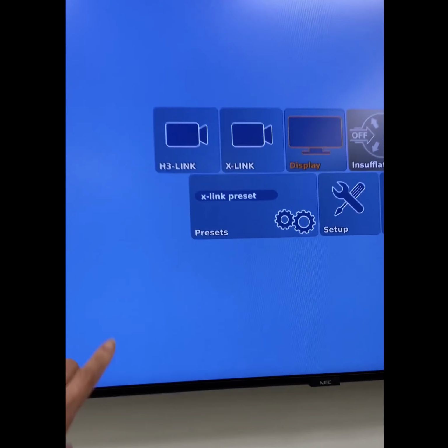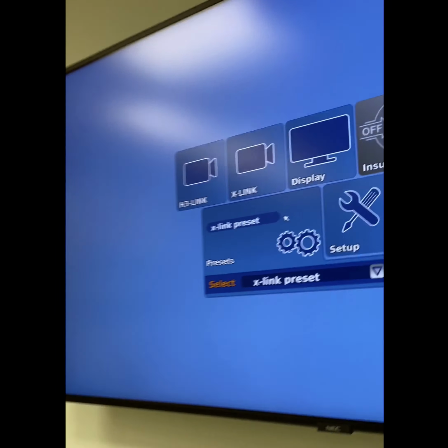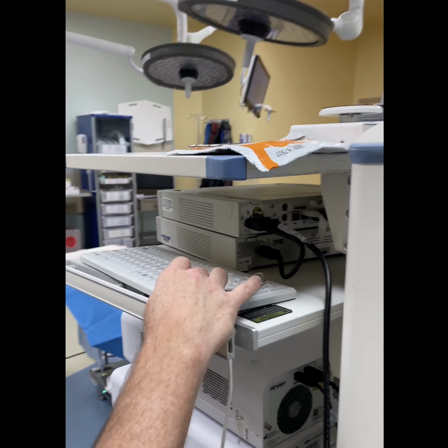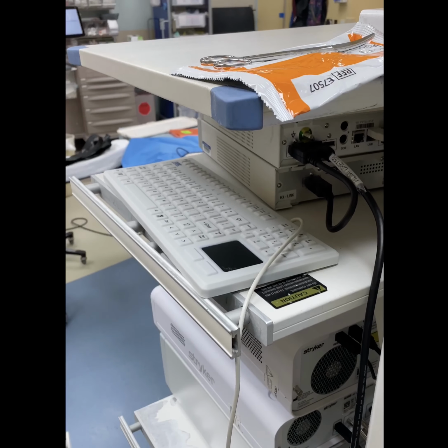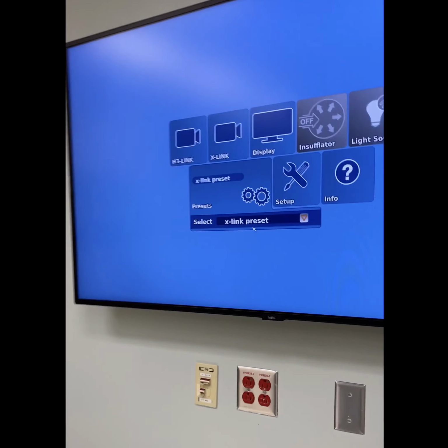You always want to make sure that your preset is set to the X-Link preset, and the way you're able to change that is you use the keyboard that's on your boom, right there, and the mouse pad is that black square in the right bottom corner. And that's how you're able to move around and change it to X-Link.